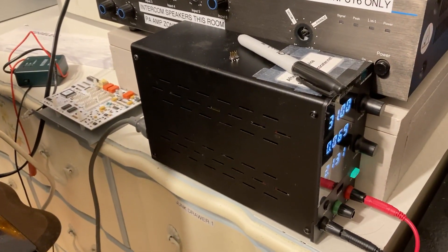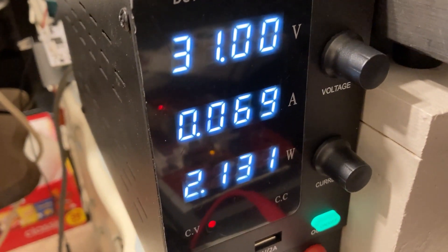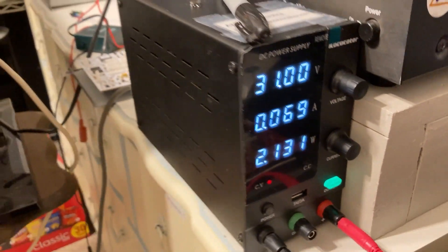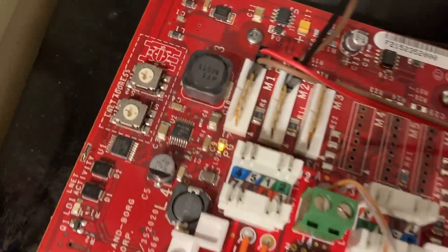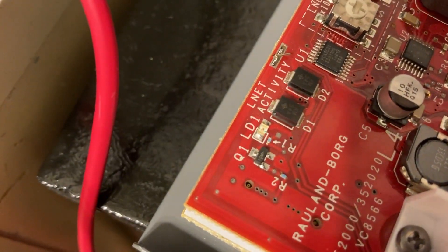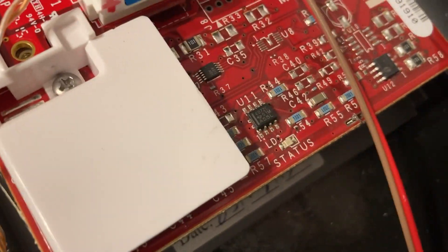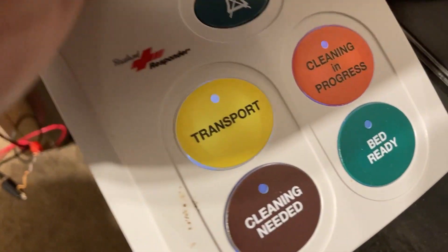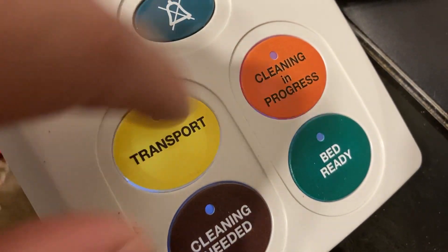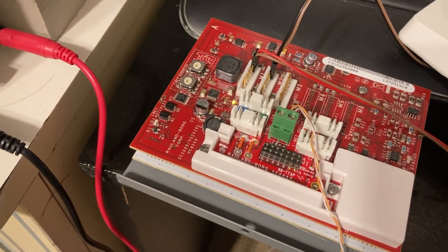We've got a bench power supply right here, just a typical one off Amazon. I have it set to 31 volts with the current set to 500 milliamps. The leads go down to this board right here - a board within a board - and it has all these little indicator lights, like one for L-net that just stays on all the time, and a status light. I have two responder buttons connected to it, you can faintly see they're glowing and then they flash red every so often.